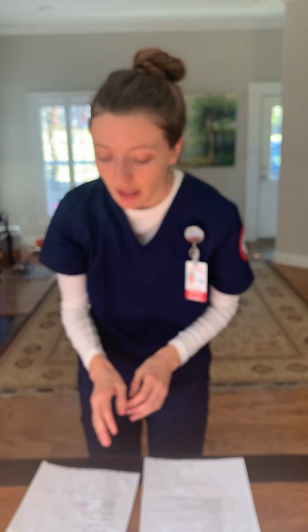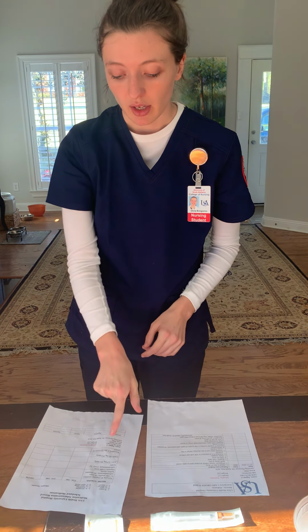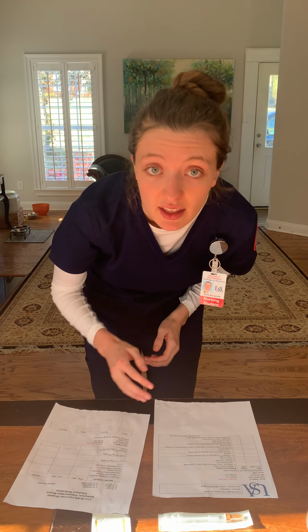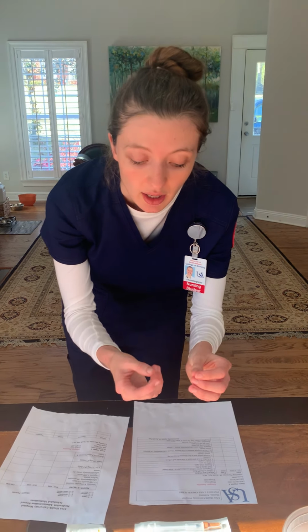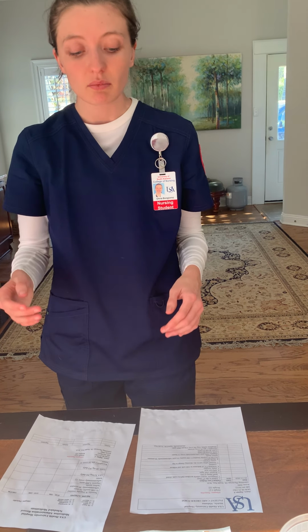Before I do anything, I check the math. Jaguar Jones requires heparin of 5,000 units, and the heparin in my vial is 10,000 units per milliliter. So in my 1 milliliter syringe, I will draw in 0.5 milliliters of heparin.